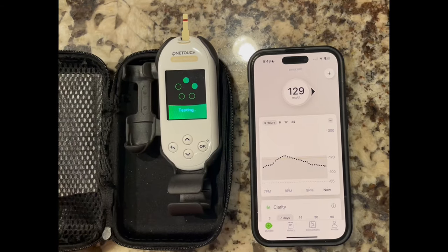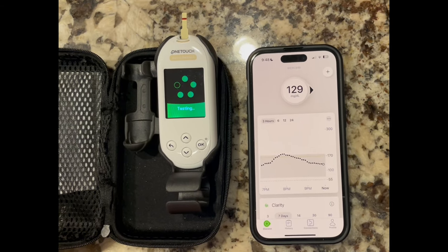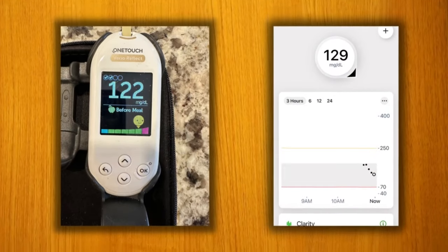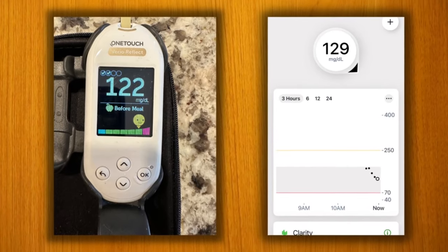So how accurate was the new Dexcom G7? To test this, a few times throughout the 10 days when I was wearing the sensor, I compared the Dexcom G7 readings to a finger stick. The first time I wanted to test it was right when I put on that brand new sensor, because a lot of times that first day with the new CGM can be the most inaccurate. To my surprise, I found the reading was actually within a few points — the Dexcom G7 was giving me a 129 and the finger stick was at a 122. So this was just a few points off, and that was just within a few minutes of starting the new Dexcom G7.